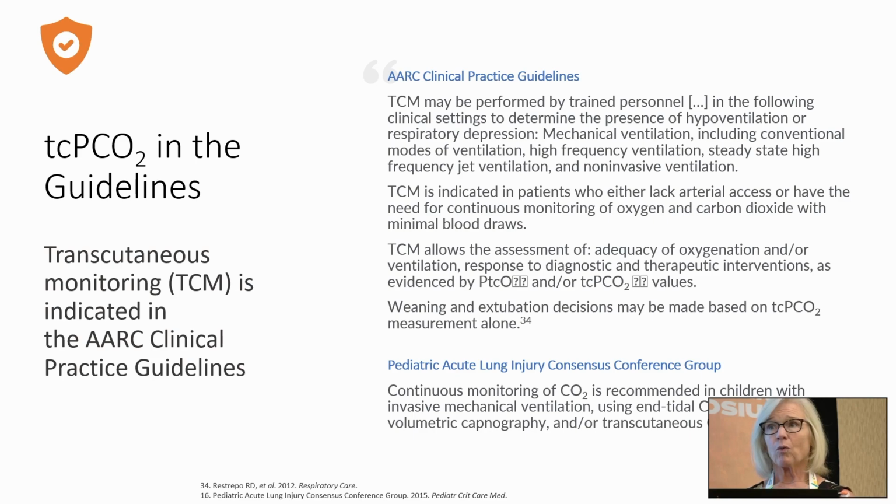More and more, we are seeing guidelines coming out from the AARC that state that transcutaneous monitoring should be used when you are mechanically ventilating a patient, and that you can rely on it to guide your mechanical ventilation. It's indicated on patients who are on non-invasive ventilation, patients who are on high-flow cannula, patients who are not intubated. And they do say that weaning and extubation decisions can be made based on your transcutaneous measurements alone.